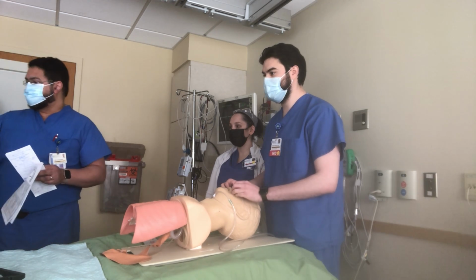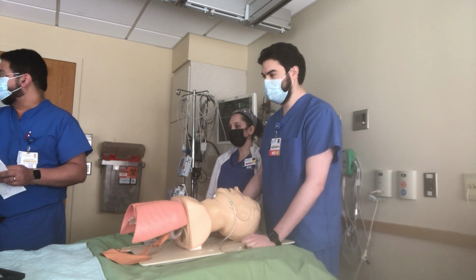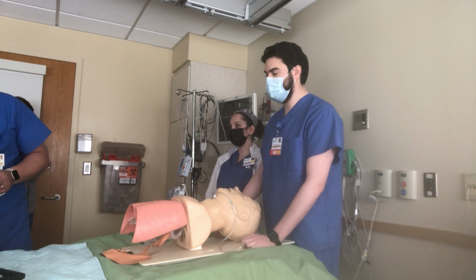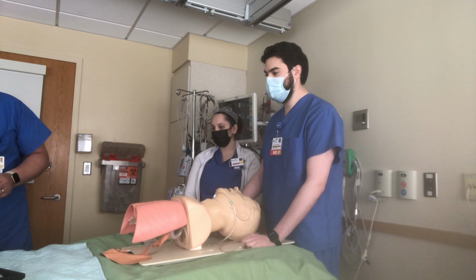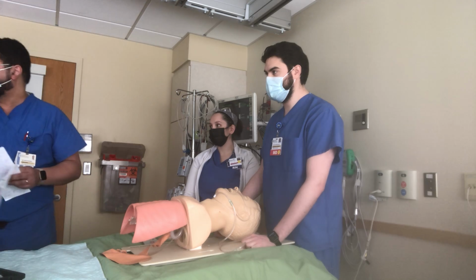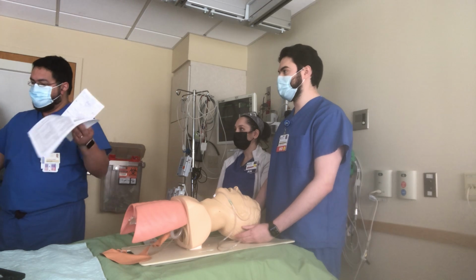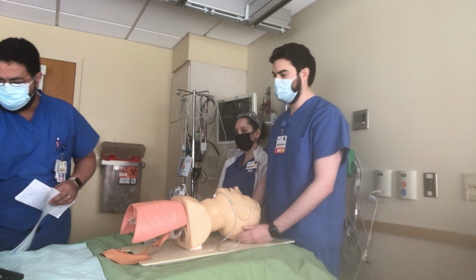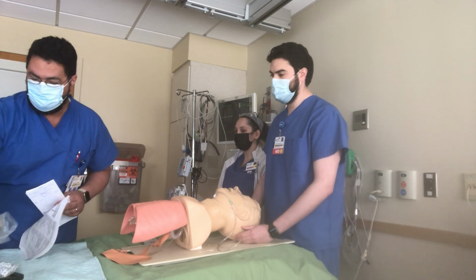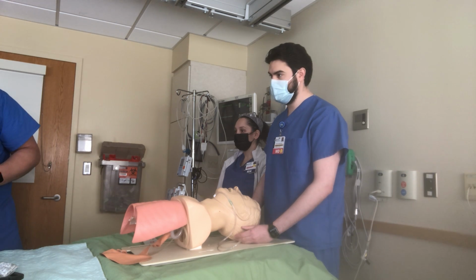So can somebody else, when I say things, just find it quickly because we need to find this stuff. Just going back a little bit, when you get this box, even if it's not a difficult airway and you're just gonna use this box, there's only 3 things we need from it: the endotracheal tube, the CO2 detector, and the syringe. That's it. And the rest is glidoscope, usually, when we intubate. If you're gonna use the regular scope, the Mac or Miller blade, then they're right here on the top. But typically that's what you need to get you started, and other things are available in the room.